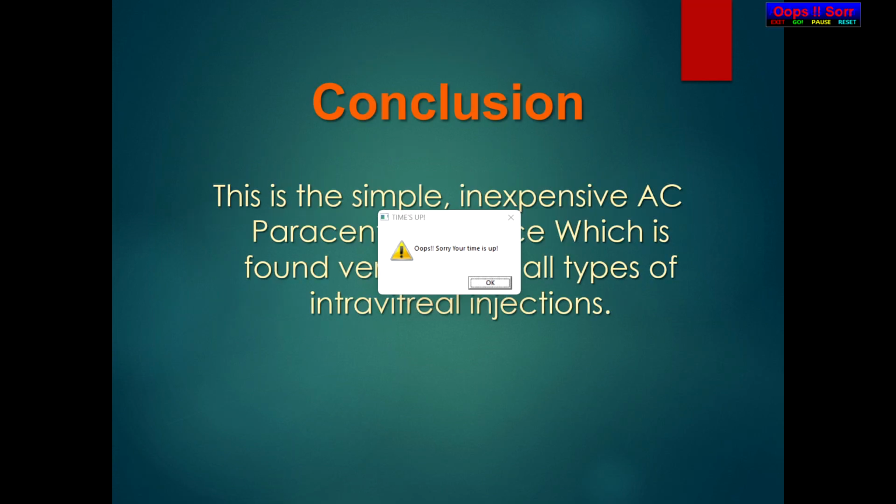So to conclude, this is a simple, inexpensive AC paracentesis device which is found very useful in all types of intravitreal injections, especially in triamcinolone and multiple injections in endophthalmitis. Thank you very much for your patient listening.